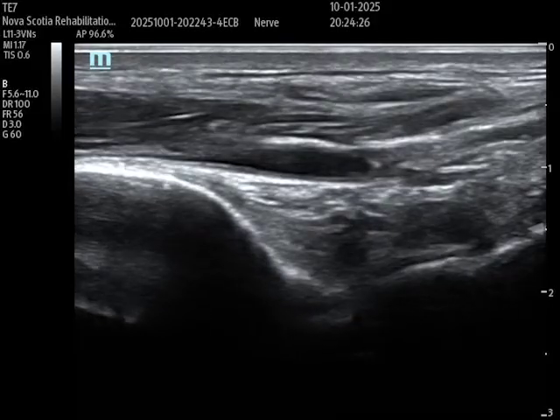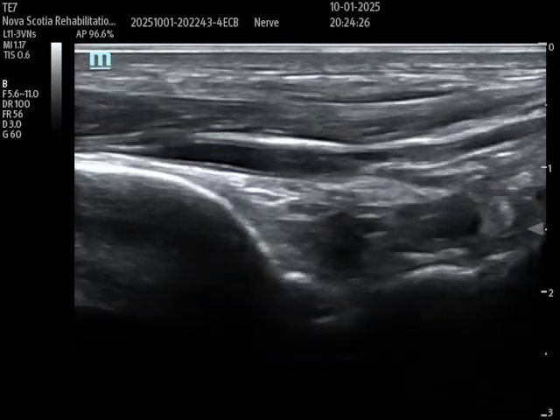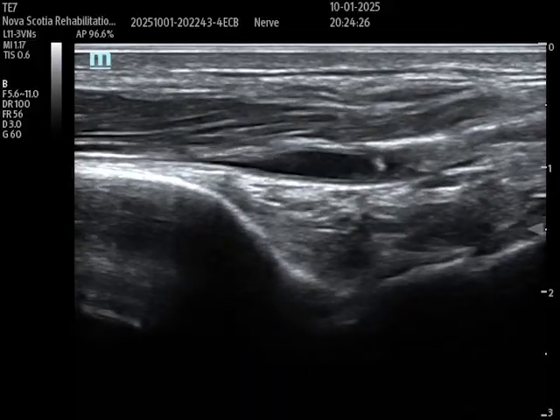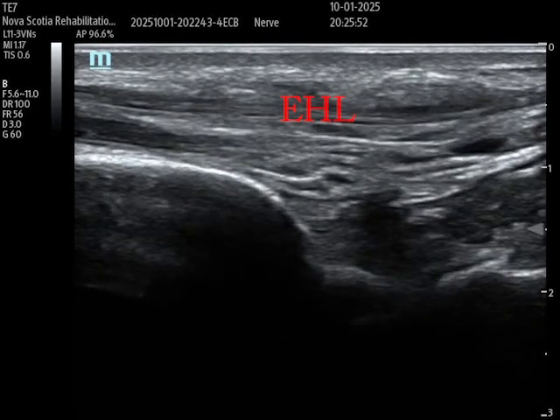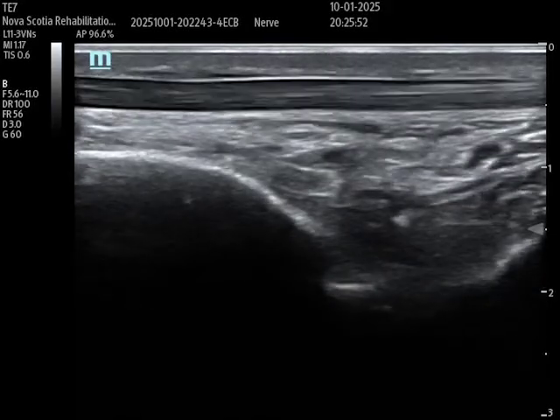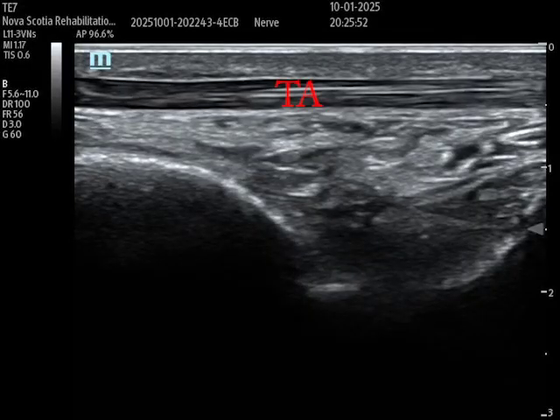I'm going to take the ultrasound probe, again in long axis, and translate medially to get away from the artery. There's the artery, and now I'm translating a little bit medially. There's the EHL, or extensor hallucis longus tendon — I don't want to inject through that. So I'm going to translate the probe even a little bit more medially. There is the outline of the TA, or tibialis anterior tendon — that's quite thick and I want to avoid going through it.